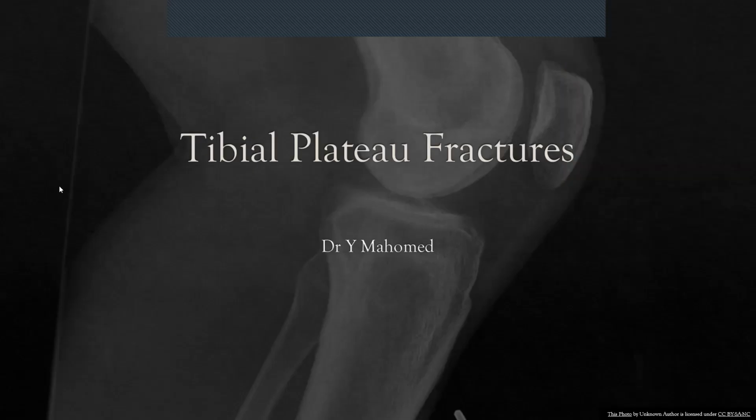Hi everyone. So we're just going to have a slightly longer look at a common problem that we often find in the emergency department, but also something that's quite often missed, unfortunately. And these are tibial plateau fractures. So we're carrying on with our emergency radiology sessions, and let's hope we can learn something from this as well.